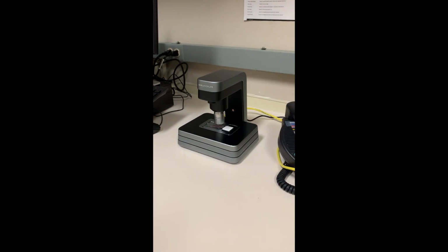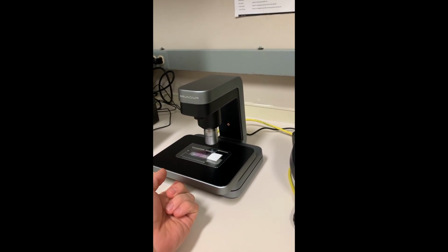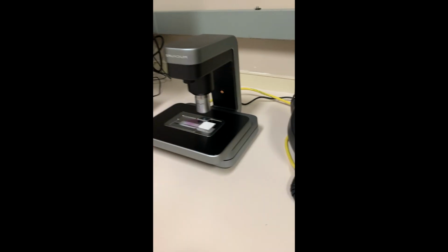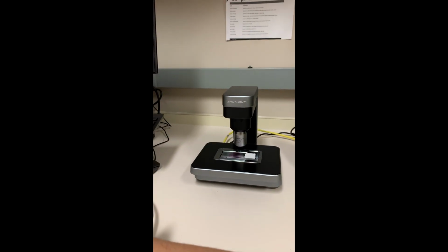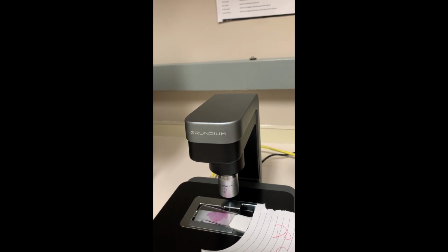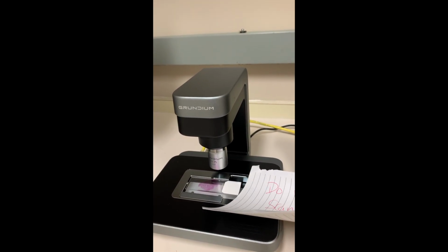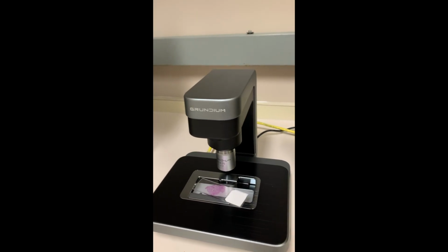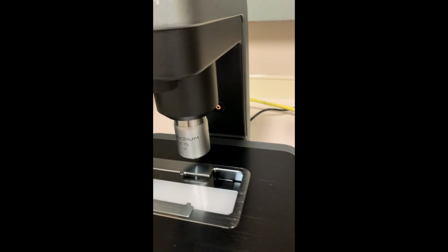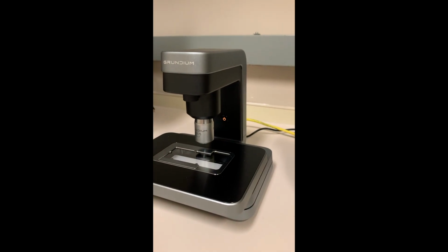Just a real life tip. I'm going to just ask to eject the tray. I'm going to do the thing to release the lock, and I don't want to get my finger oils on the slide tray there. So if you have a piece of paper or something, I just lift up. See, I just did that, got underneath it and brought it over the edge, and then I was able to slide it off, and I didn't get my fingers onto the slide tray or on the Grundium lens itself.